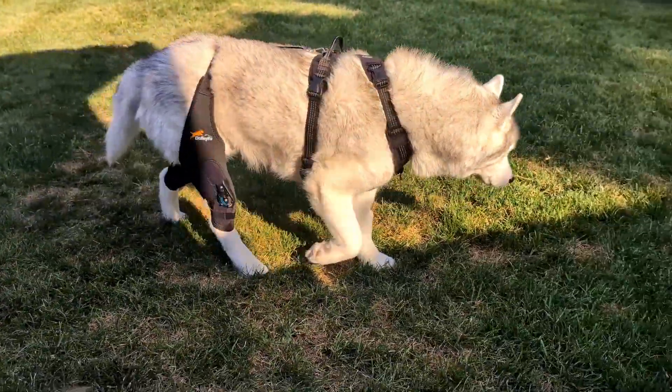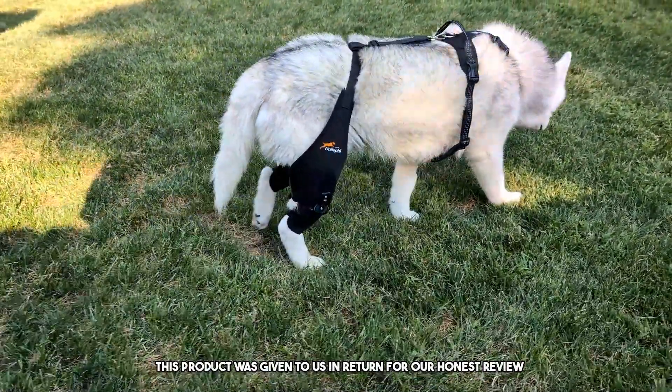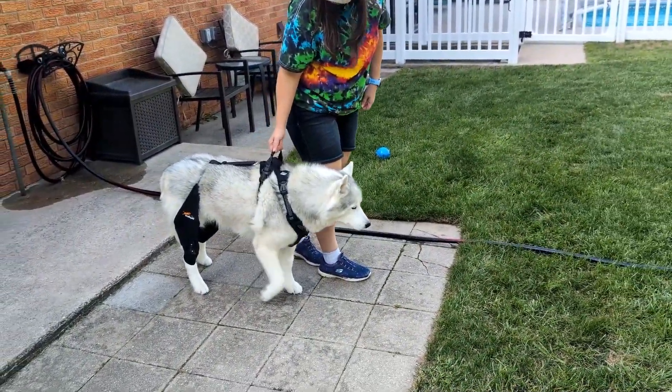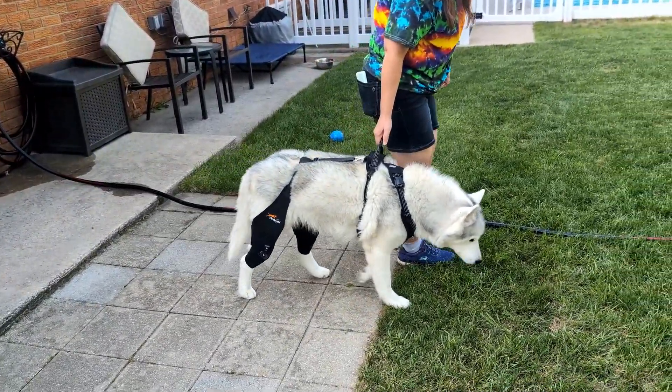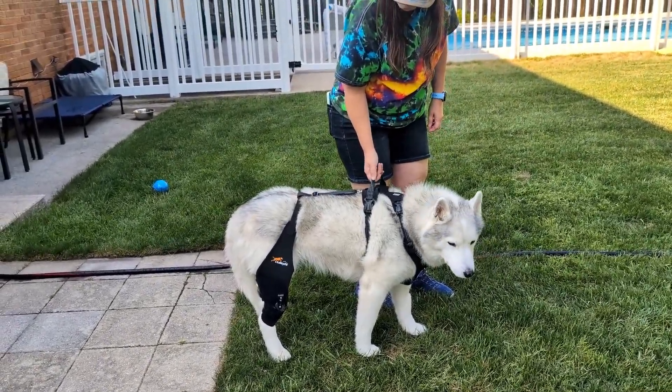Welcome to the review. Today we're doing a review of this dog knee stabilizer. This product was sent to us in return for our honest review. Our senior dog, Memphis, had knee replacement surgery on one knee, and she injured her other knee not long ago. So this is going to be great for her on the days when she needs extra stability.